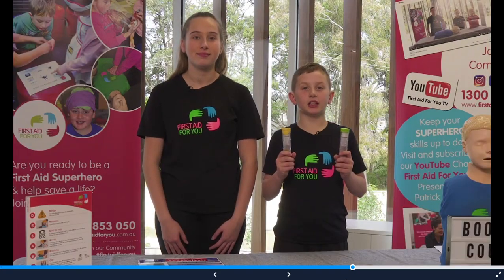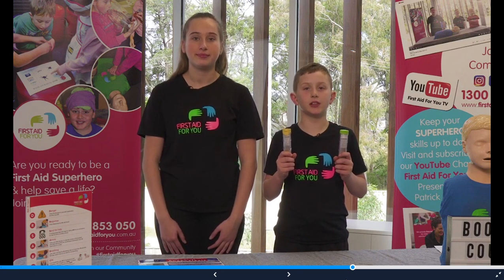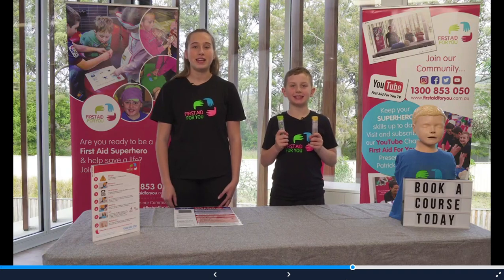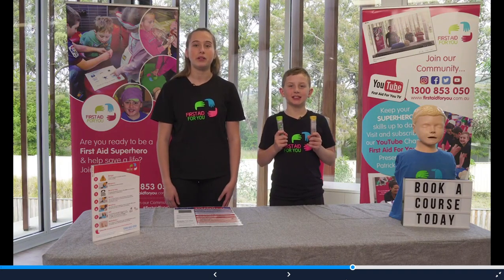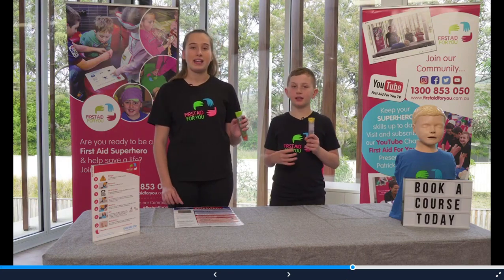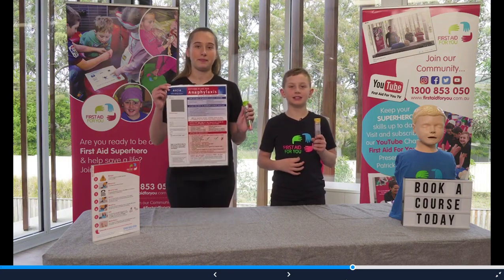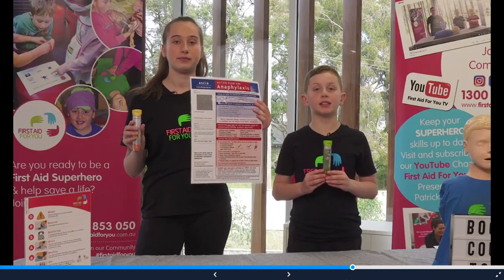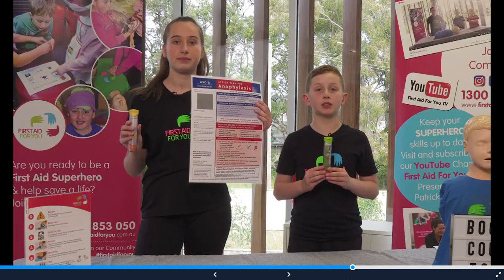An EpiPen is a life-saving medication. It must be used when someone is having a really severe allergic reaction, known as anaphylaxis. Our friends, teammates, brothers or sisters, or anyone who has anaphylaxis should always carry around their EpiPen and a copy of their action plan. Both these tools are life-saving. The EpiPen is a special medicine that we must give correctly to help save their life.